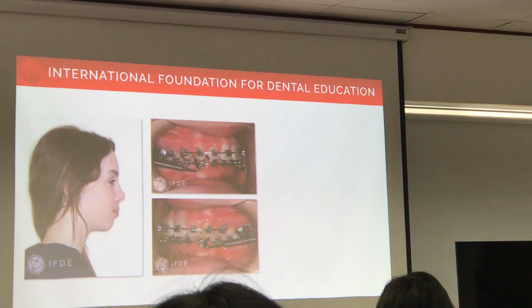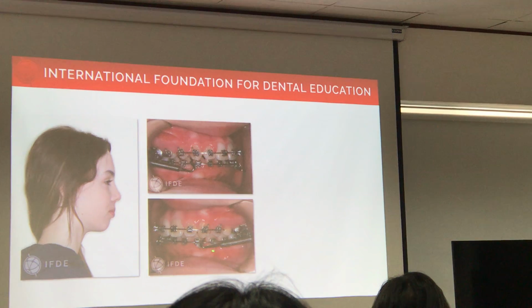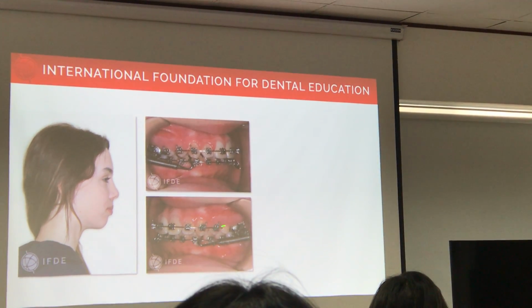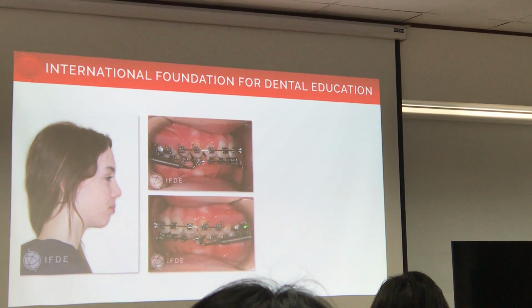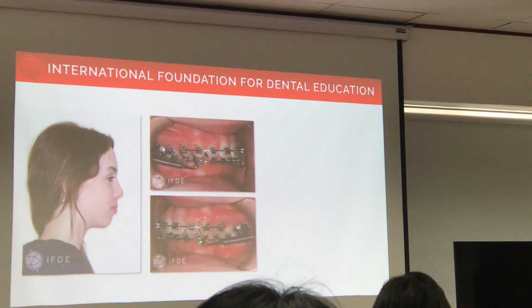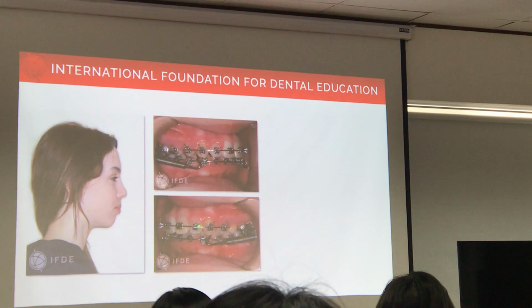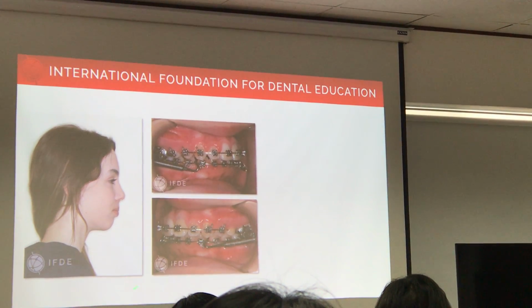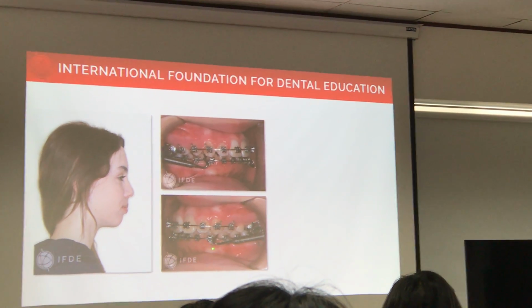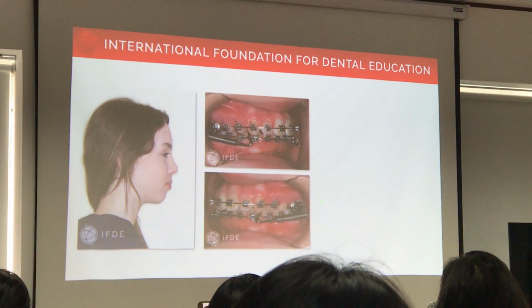You get it or not? It's a bit more difficult to install it. See, the forces is actually coming from the back of the tooth all the way forward, not from the front of the tooth to here, because it's too much vertical. But she has a vertical grower. I don't want the forces to push the teeth back. The lower, she's already coming up, so you see it's almost horizontal. It's designed this way.